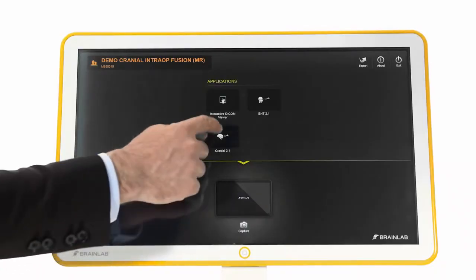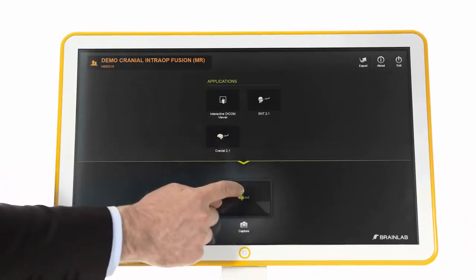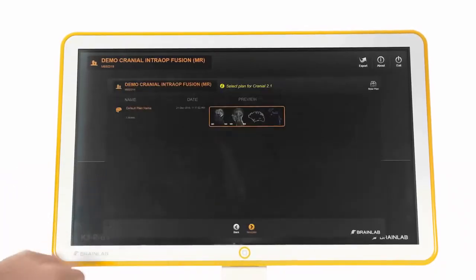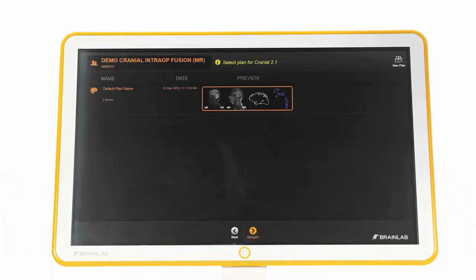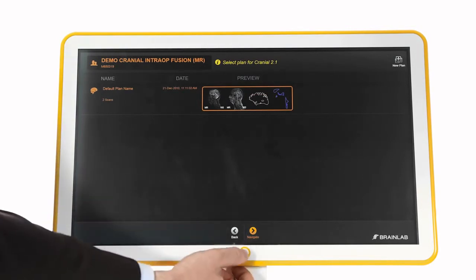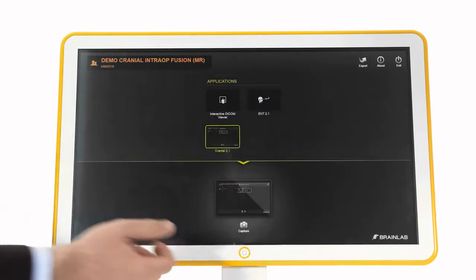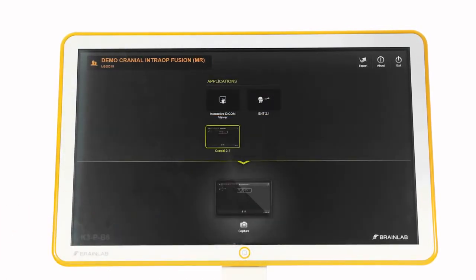KIK features drag-and-drop functionalities for system control and content management. The home button functions as the gateway to the software, leading back to the start screen for easy navigation within its various applications.